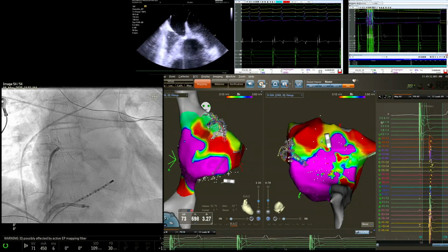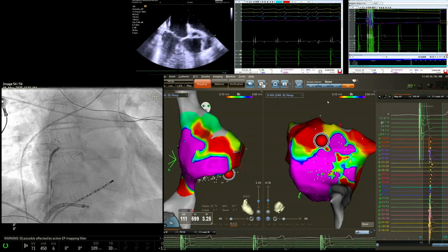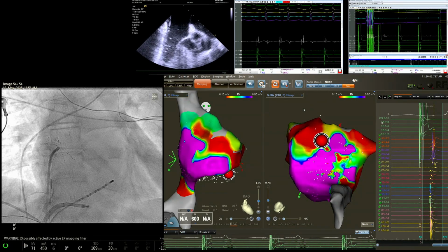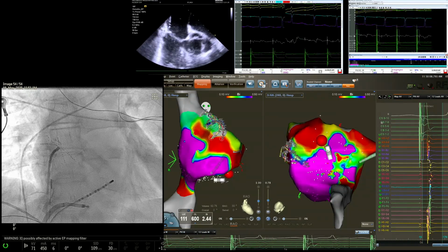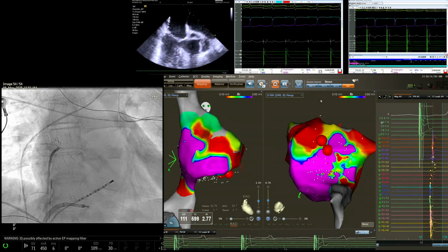Are we ready? Let's go ahead and take a point there. We don't have enough points over here to take from. All right, what are we at? Okay, 1 minute. Let's go ahead and hide ablation. Live. Let's go back here. Hide ablation.